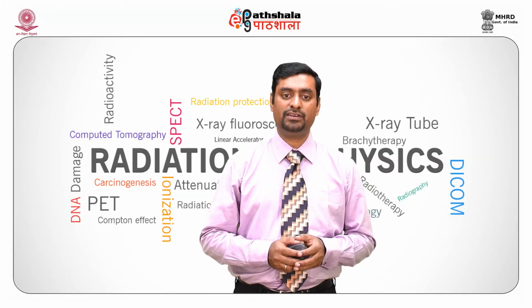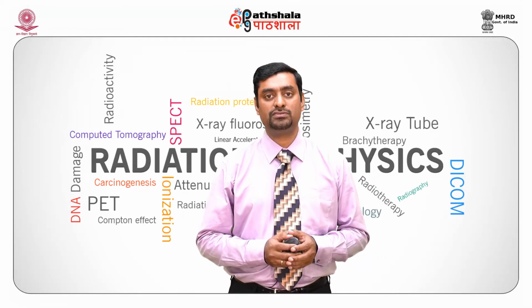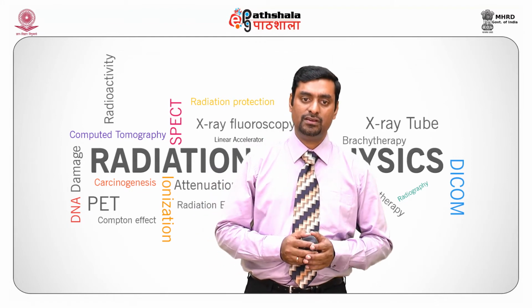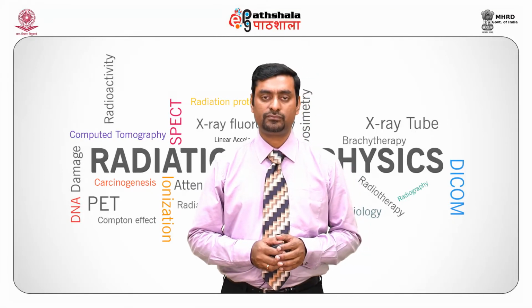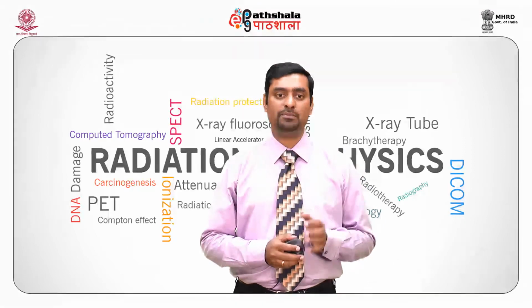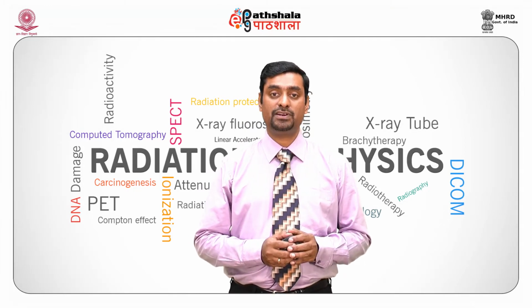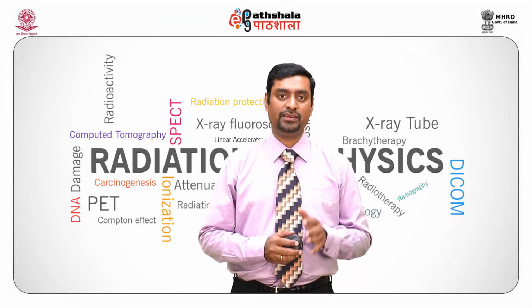Cesium iodide scintillator material, which has higher packing factor and higher spatial resolution, is normally selected for mammography purposes. This cesium iodide scintillation detector or crystal is vapor deposited on the amorphous silicon detector array. The cesium iodide crystals grow in a tiny needle shaped light pipe arrangement which resembles a fiber optic cable. It internally reflects light and minimizes light spread. It has high X-ray absorption and very high spatial resolution.